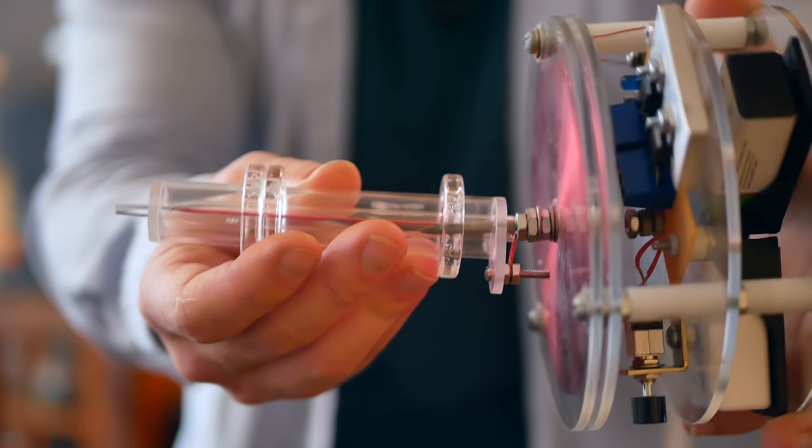Ideally, the power source would be onboard, but this is just a prototype. Should I build another wand with an onboard power source? Well, that's what the comments are for.